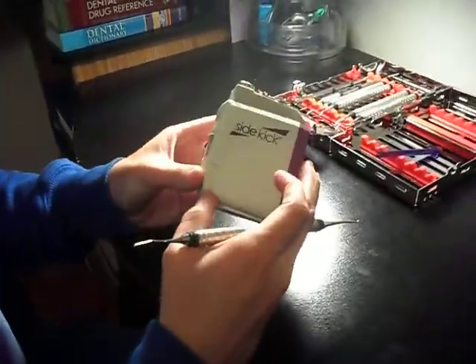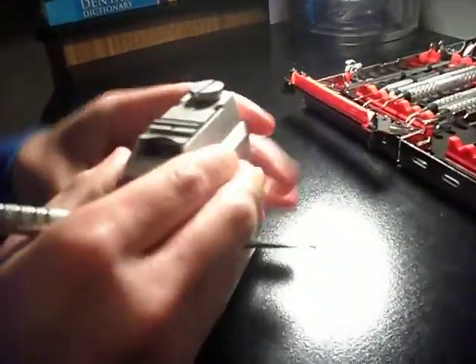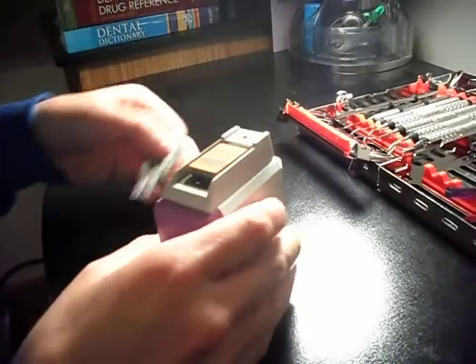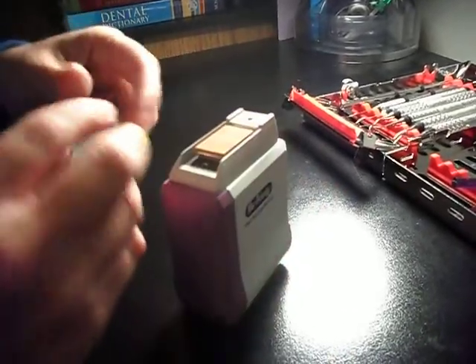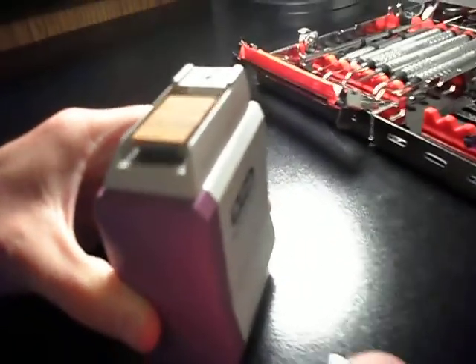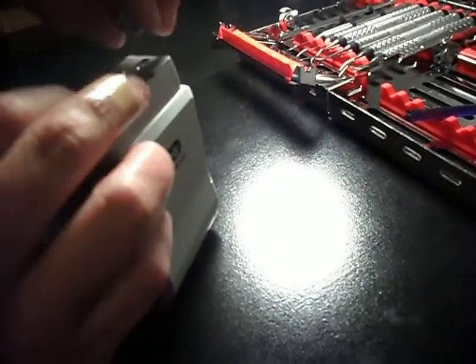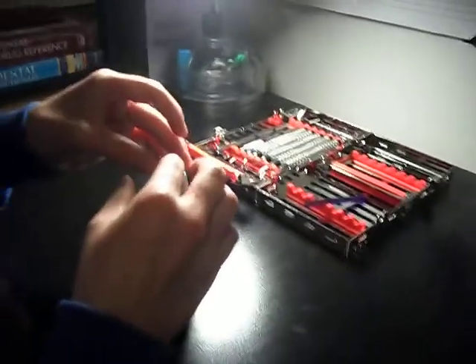Now, what we have here is called a sidekick. This is a stone that's pretty rough, actually. And when you turn it on, it moves back and forth. And when you move the blades across the stone, they get sharp. So, I'm going to demonstrate how to sharpen a supragingival scaler and a subgingival curette.